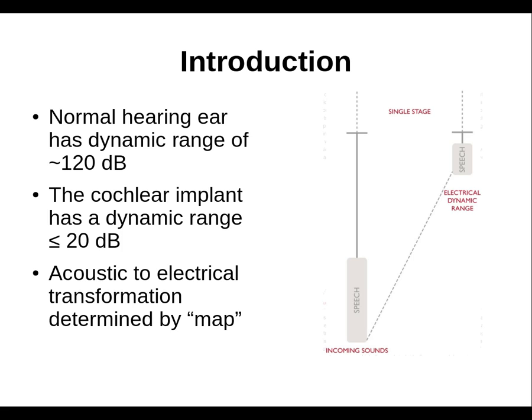We know we have a similar but lesser problem that occurs with hearing aid users, where we're trying to take the dynamic range of normal hearing, maybe approximately 120 decibels if we're talking about on the low end detection threshold, and on the high end feeling of discomfort. Maybe a little less than 120 decibels, but roughly that. We're trying to compress it down into the residual dynamic range of, say, the hearing aid user.